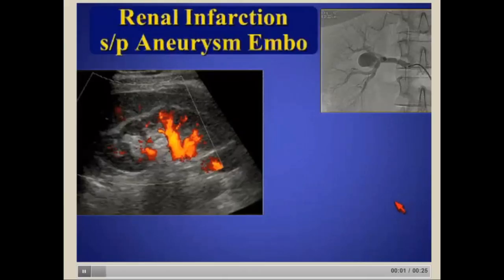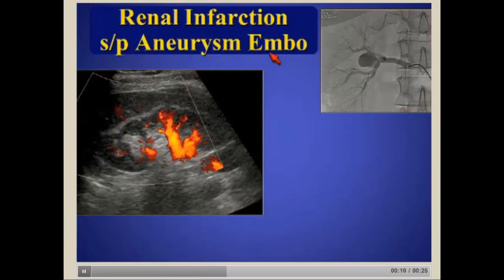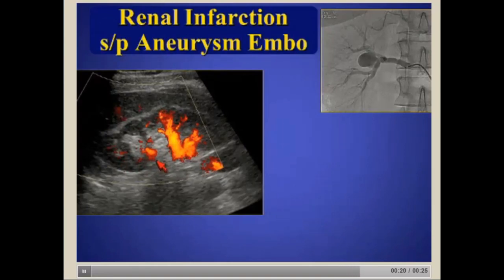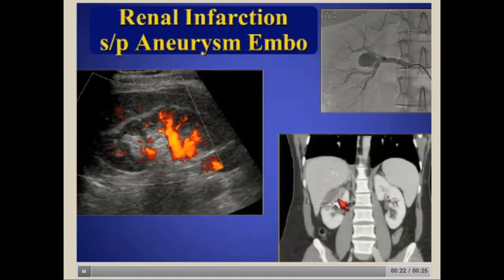Here's a patient who had a renal artery aneurysm that underwent embolization and developed pain after the procedure. On our power Doppler display, you can see very poor perfusion of the upper pole — this patient developed an infarct in the upper pole following the procedure, confirmed on CT where you can see the coils placed within the aneurysm.